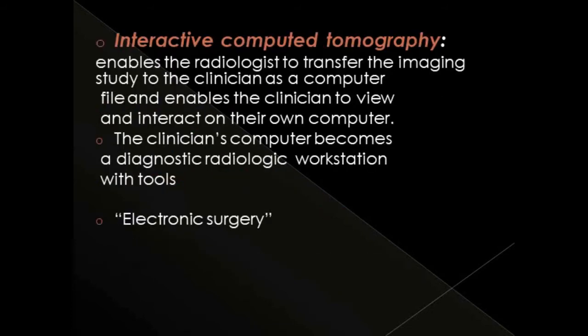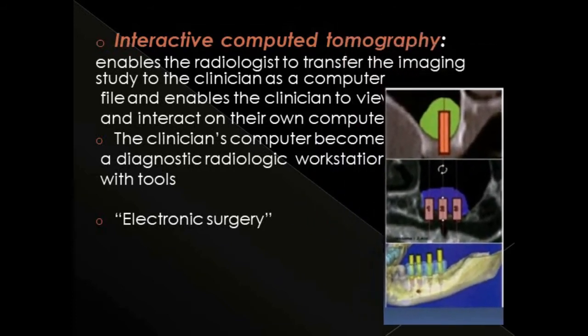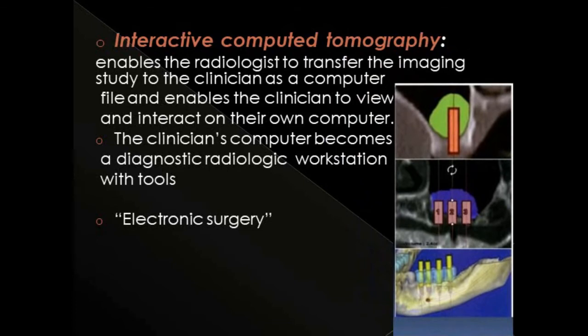And the next one is interactive computer tomography. So this technique enables a radiologist to transfer the imaging study to the clinician as a computer file, and it enables the clinician to view and interact on their own computer. So basically here the clinician's computer becomes a diagnostic radiologic workstation with tools.